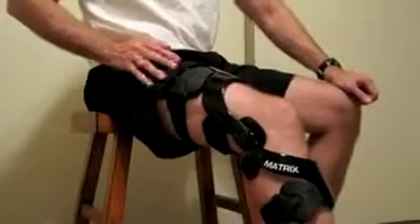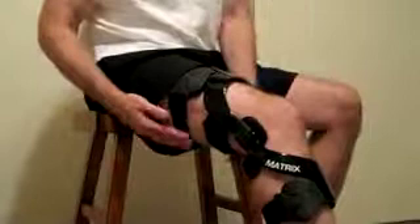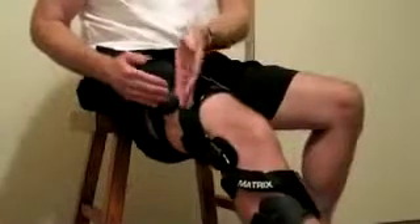Steps for removing the matrix knee brace from the leg. The straps can be removed in any order. The important thing is that the straps are always removed from the lateral side, or outside, of the leg.